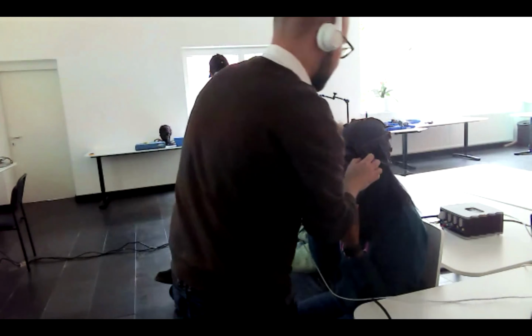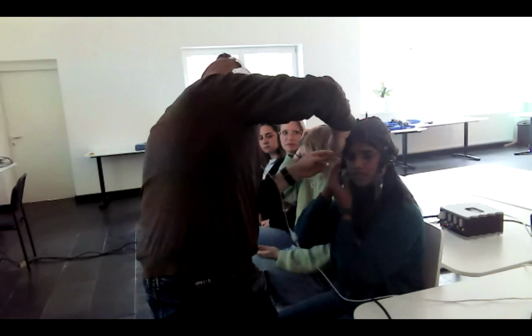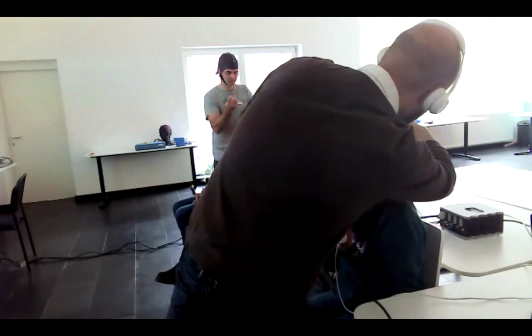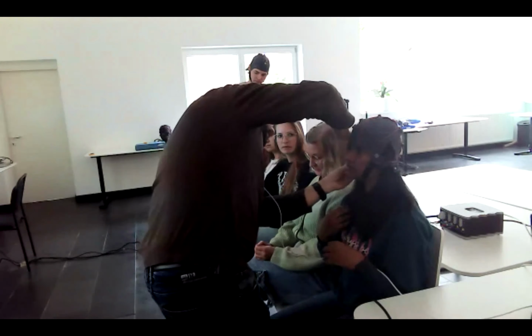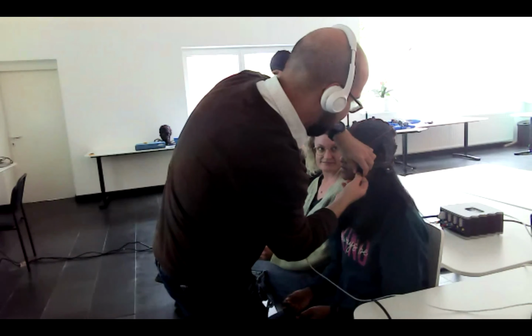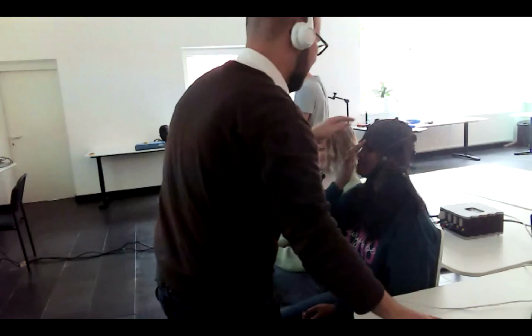To be super precise, you should always use tape to check the differences of the skulls. This is very good. I will just measure Nasion and Inion, and the Cz should be a bit more to the front. And we will just plug it in. I need to close it together. How are you? Are you comfortable? How are you feeling? Nervous? Very good. Okay, great. So we will do the gelling.